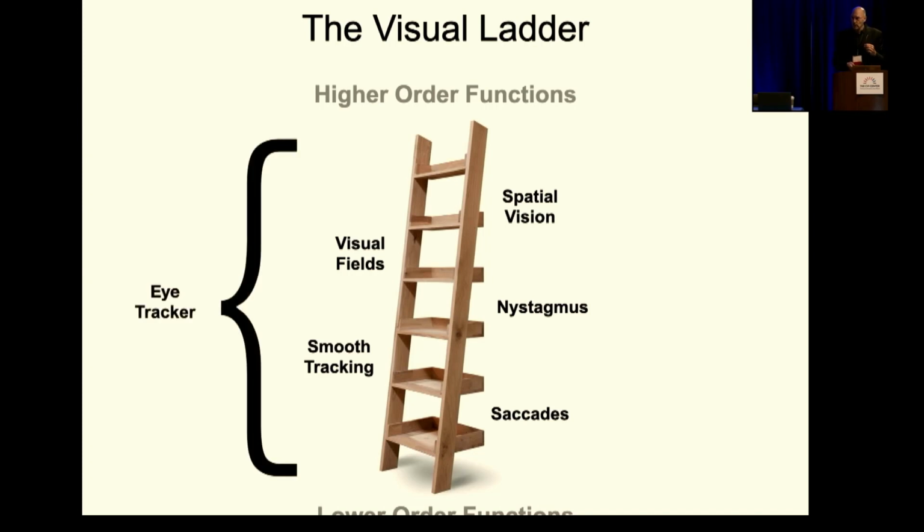We think eye tracking and fancy computer processing. We do this stuff in a frame-by-frame way using video card analyses that is happening in gaming all the time to do this. It allows us to do it quickly and so forth. Here's sort of an idea of what this visual ladder does. They're stripped down little versions of what we're doing. The green marker will show you where the gaze is, but that isn't on the screen when we do it, but just to show you how gaze can control this.